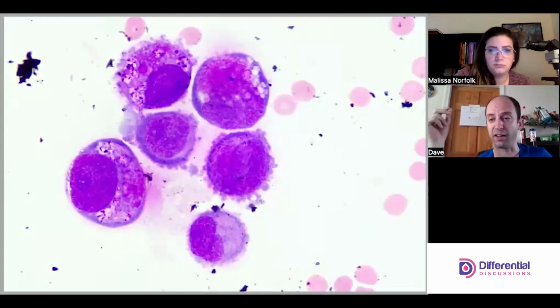And we can follow that line of thought too, right? If we want to be responsible and we're in an area of our own ignorance and we say, is this possibly a lining cell? So the question then begs, what is a lining cell in CSF? So we grab the textbook, we look it up, and we see leptomeningeal cells. You're going to see, hopefully in your lab, you have some kind of an atlas or reference. And if we looked at leptomeningeals, they don't look like this.